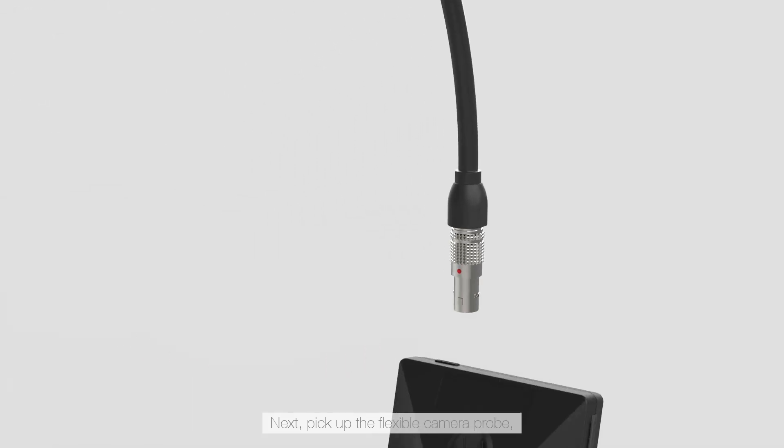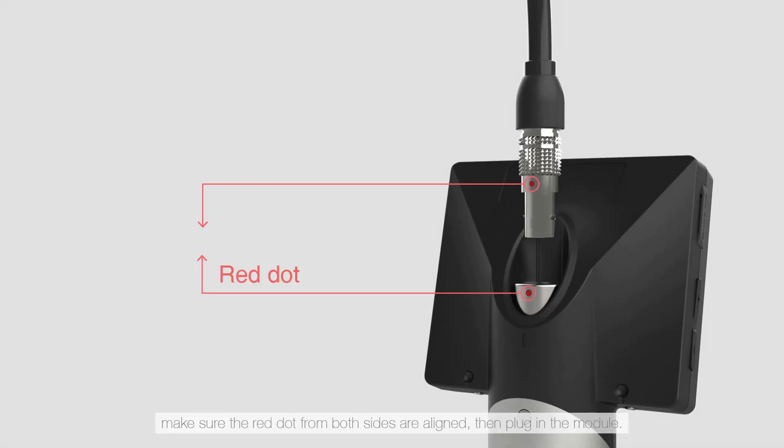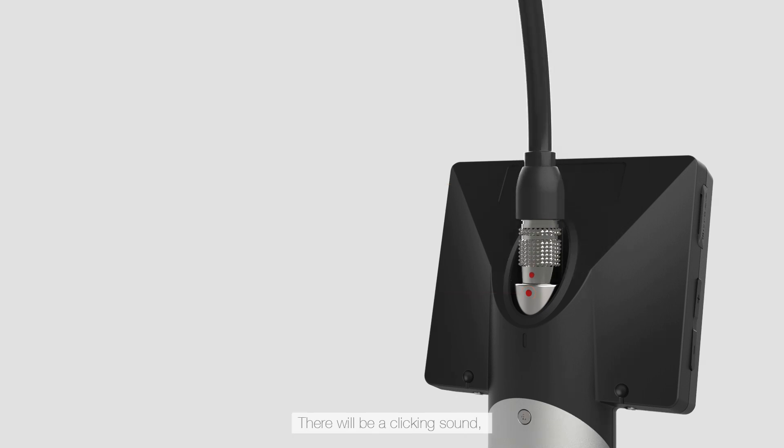Next, pick up the flexible camera probe, make sure the red dots from both sides are aligned, then plug in the module. There will be a clicking sound indicating that the module is successfully connected and is locked in place.